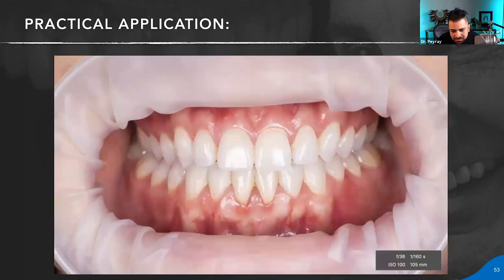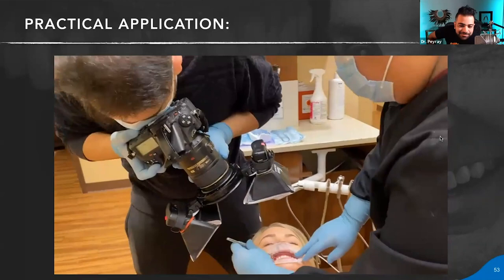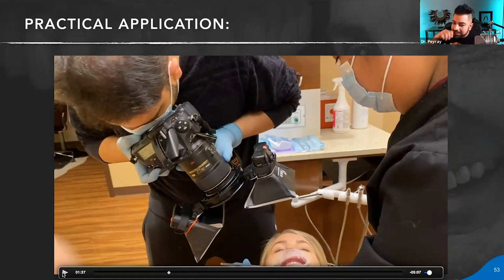So you could see now, very quickly. I'm going to change it on the right side. It's kind of like 45 degrees, because we wanted less light. Another thing I could do when it was so light out there is to turn the lights down or turn my flash down and keep my f-stop. If I was in love with that f-stop, then I'll keep it. But normally, I like to change the aperture always. Remember, I said aperture is the most important part.